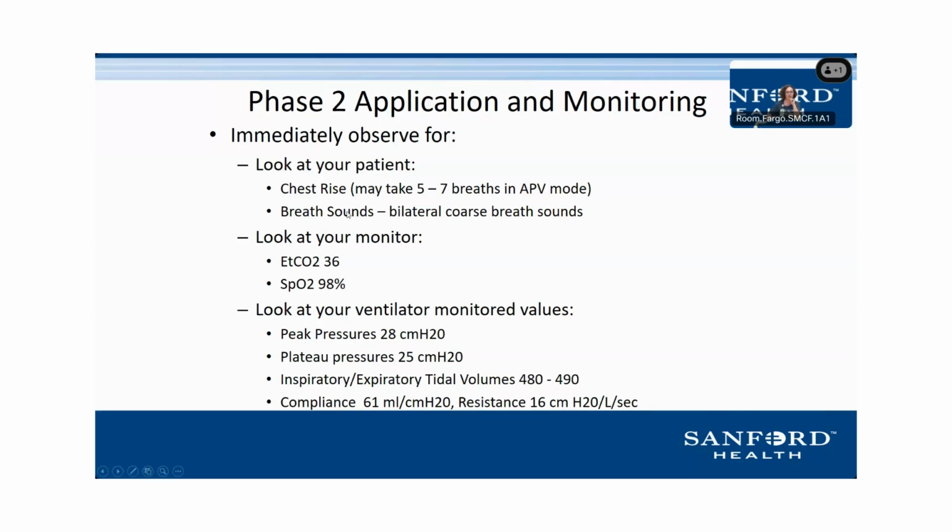We do have bilateral breath sounds on our patient, but they are coarse bilaterally. Once we verify that, yes, we are moving the chest wall, we're looking up at our monitor as well. We're still getting a good end tidal reading, which means the tube is still in the correct place. Our vital signs, we look up and they're trending upward, not downward. If we had put the patient on the ventilator and their vital signs quickly trend downward, let's take them back off, bag them, troubleshoot the ventilator. Let's see what we can do there. But in our situation, patient looks good on that.